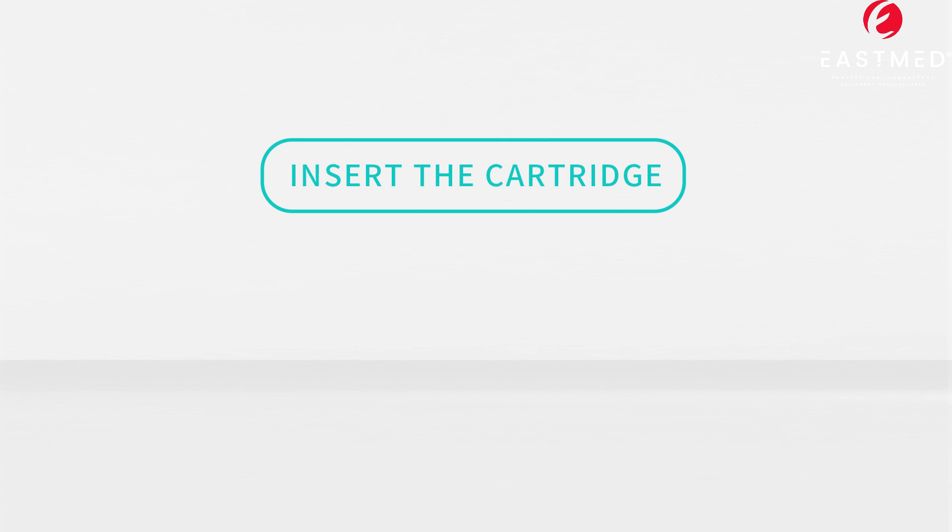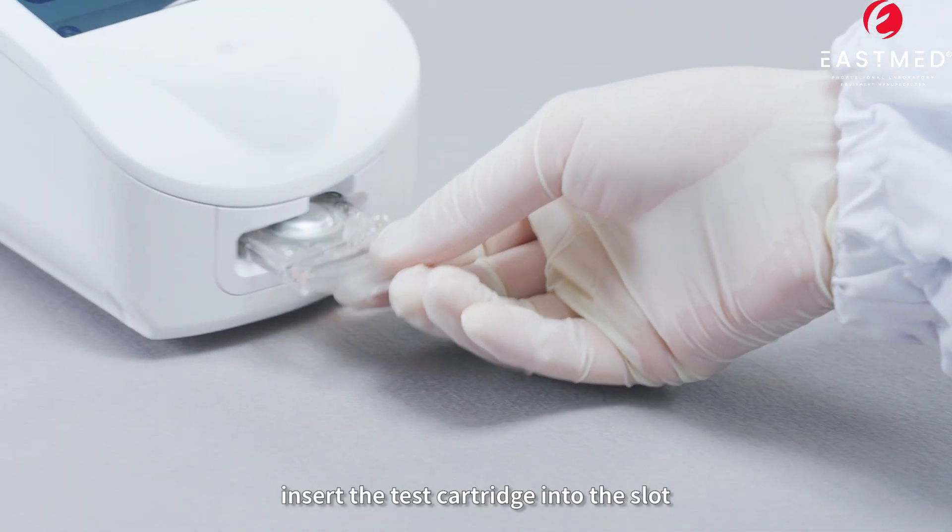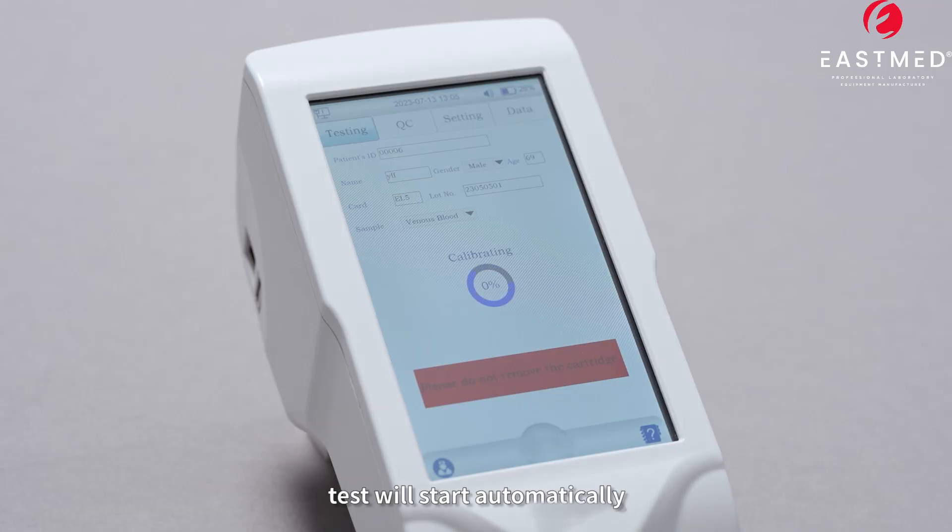Step 4: Insert the cartridge. Insert the test cartridge into the slot. The test will start automatically.